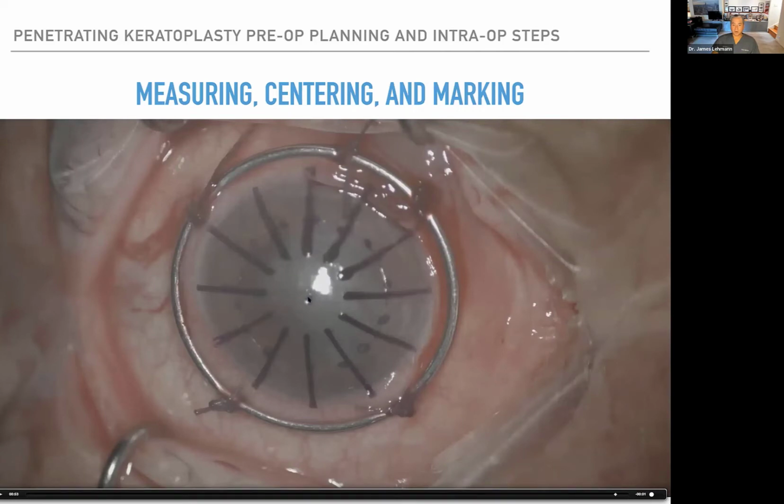You've got the central mark of the cornea. That's where you're going to aim your trephine. You have these RK markers that help you pass the sutures, especially the cardinal ones. It's not written in stone that the suture has to go through this mark, but it helps, okay?